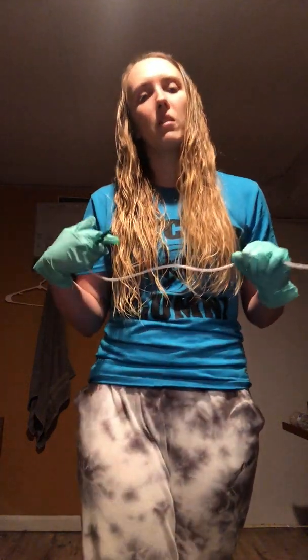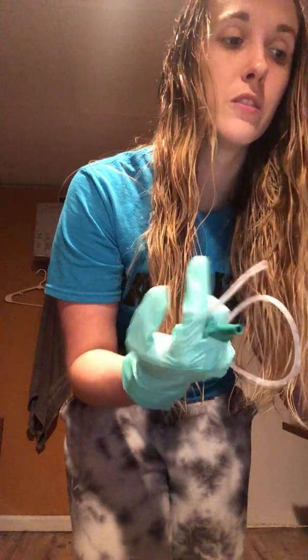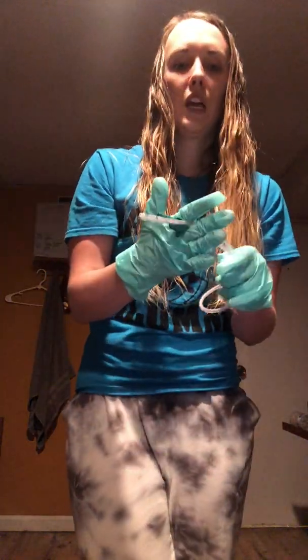So after we've done all of that, we have all of our equipment on. We're going to open our suction catheter kit. And like I said before, in here is going to be our sterile gloves. Once we open that, I'm going to don my sterile gloves. Once I do that, my dominant hand, which is my right hand, is going to be my sterile hand. And my non-dominant hand, which is my left hand, is going to be my non-sterile hand.